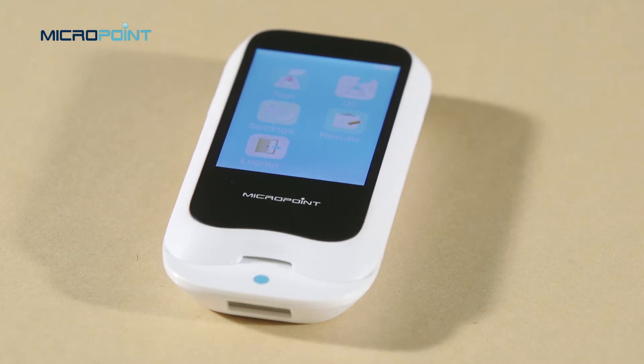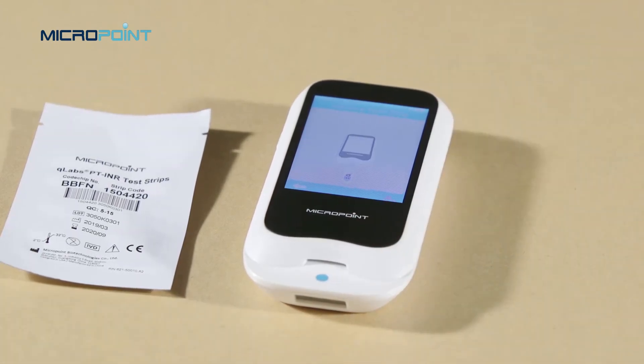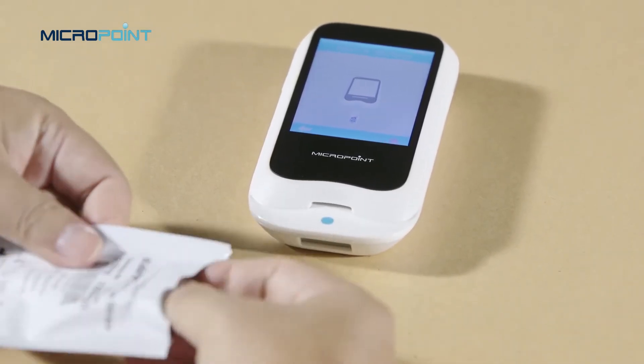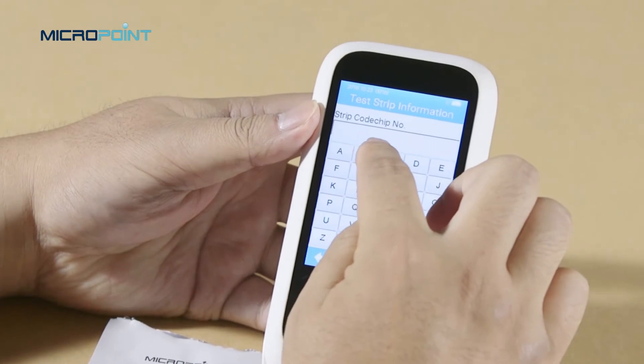We recommend that you leave the code chip in the meter to protect the electrical contacts from becoming dirty. When performing a test, the Q-Labs meter should be operated on a level surface that is free of vibration. Testing on an uneven or unstable surface may cause inaccurate results. Touch the test icon to enter the strip insertion screen, then insert the test strip. After the test strip is inserted, the meter will show the test strip information screen.